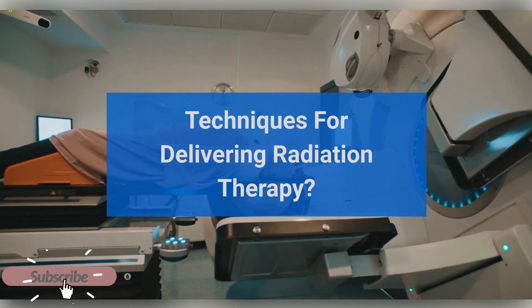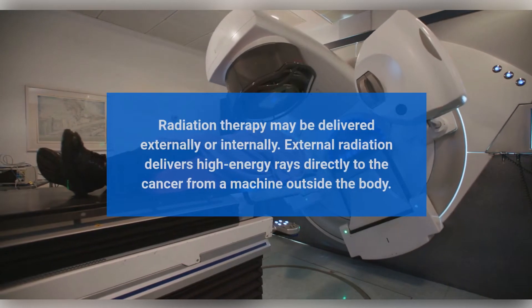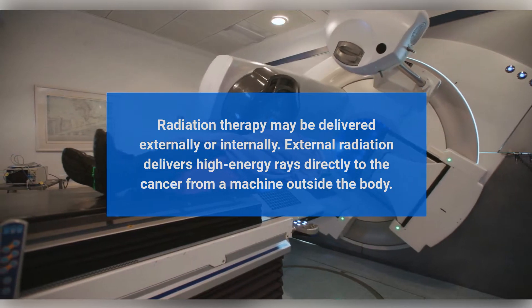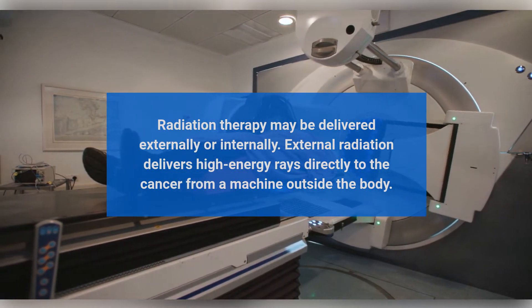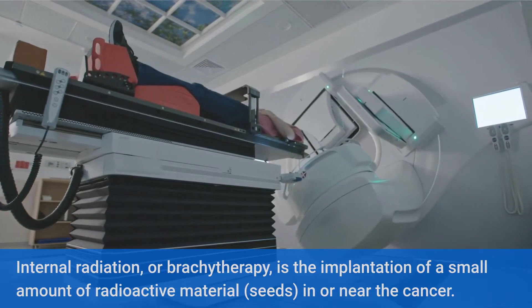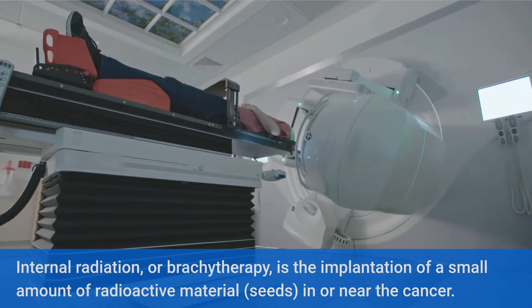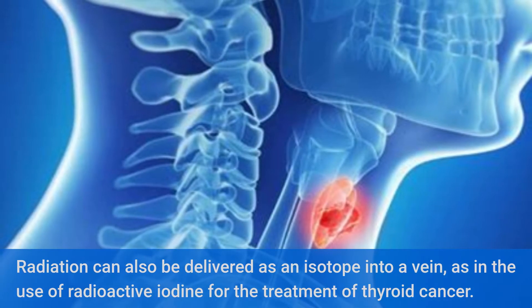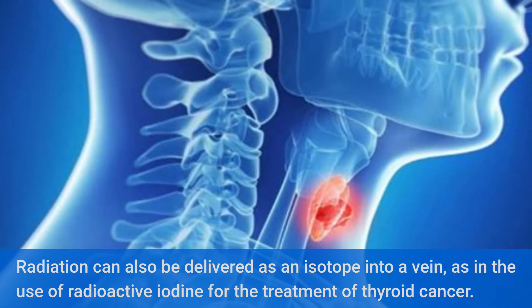Techniques for delivering radiation therapy. Radiation therapy may be delivered externally or internally. External radiation delivers high energy rays directly to the cancer from a machine outside the body. Internal radiation, or brachytherapy, is the implantation of a small amount of radioactive material — seeds — in or near the cancer. Radiation can also be delivered as an isotope into a vein, as in the use of radioactive iodine for the treatment of thyroid cancer.